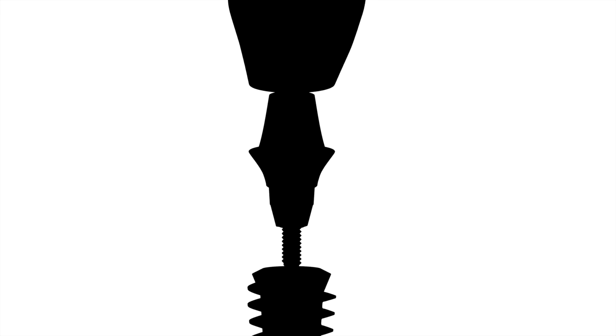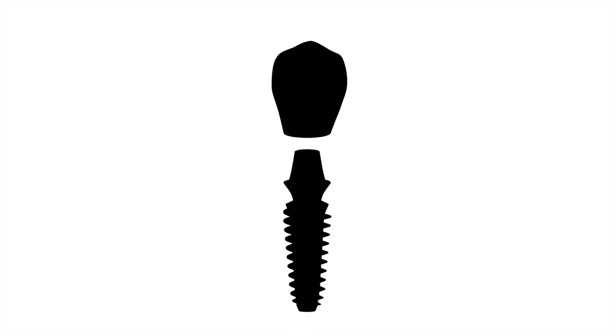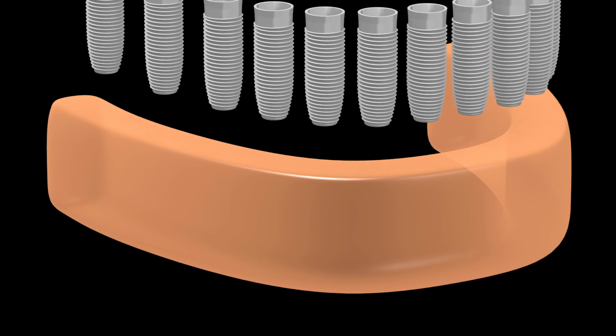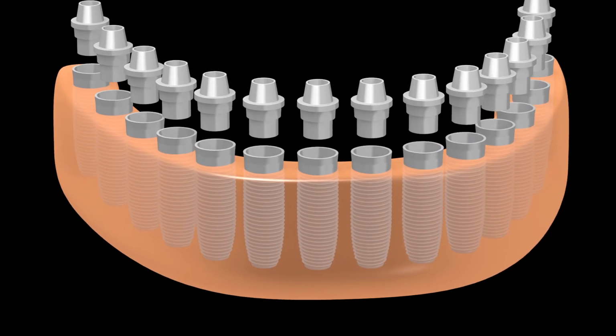Titanium bends, zirconia cracks. It is typically used as a single-piece unit, which limits restorative flexibility and means they are not suitable for all loading conditions, requiring a distinct surgical and loading protocol. The material choice dictates the limits of the screw, the abutment, and the expected long-term fatigue resistance.